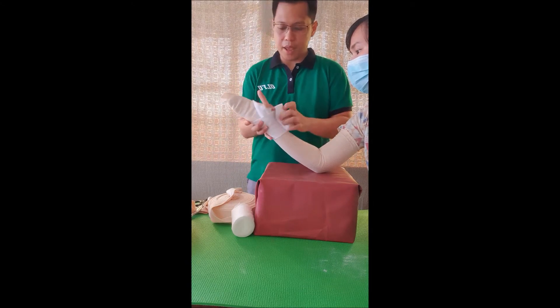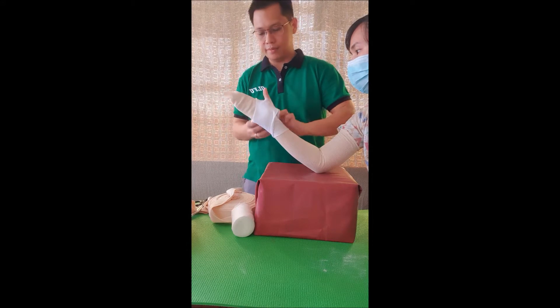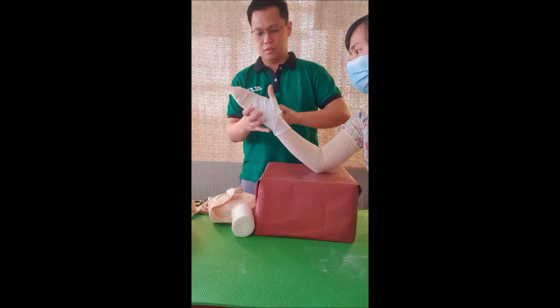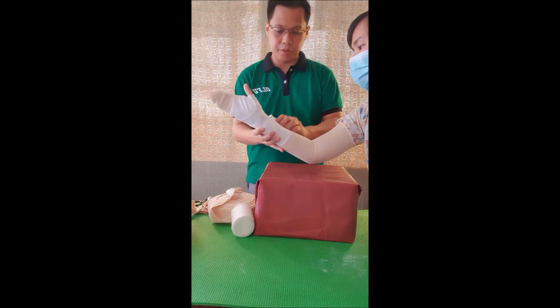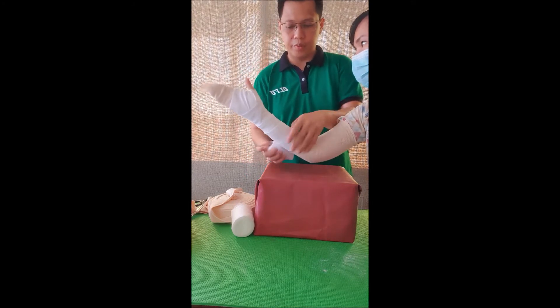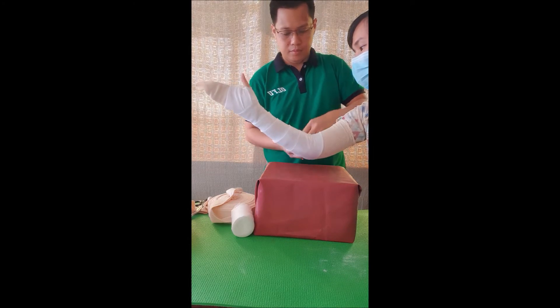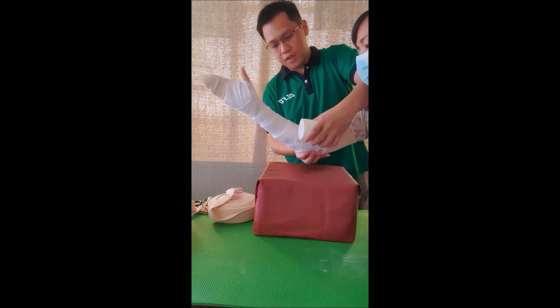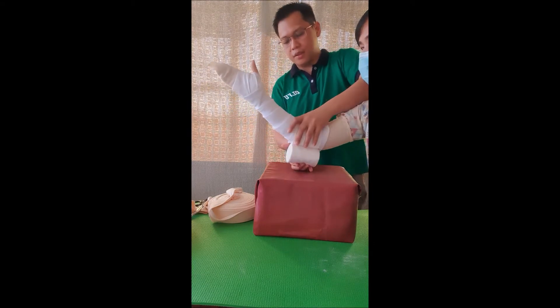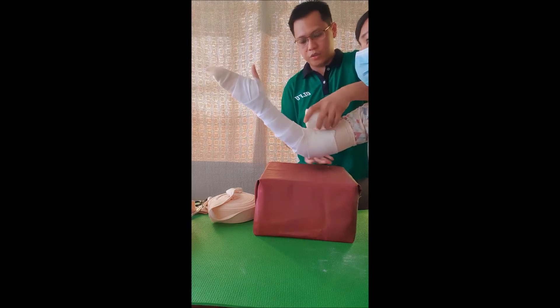We will start by applying the wadding sheet along the wrist area, going proximally with a 50% overlap of the wadding sheet. Add wadding sheet as needed, making sure that there is enough padding along the elbow area to prevent pressure sores.